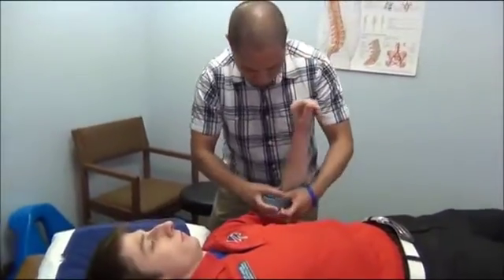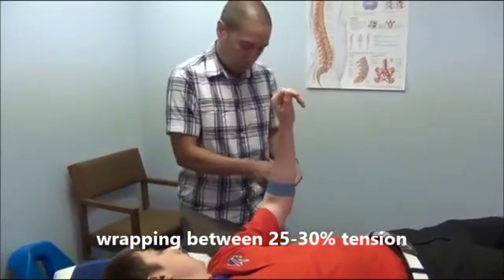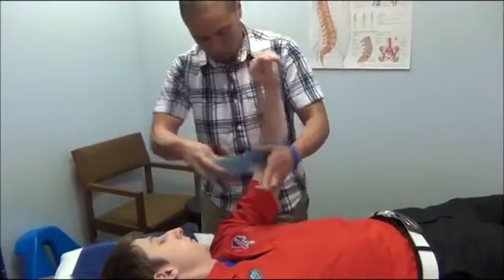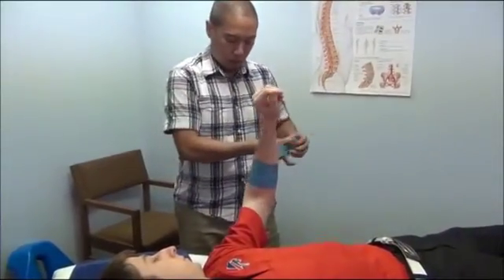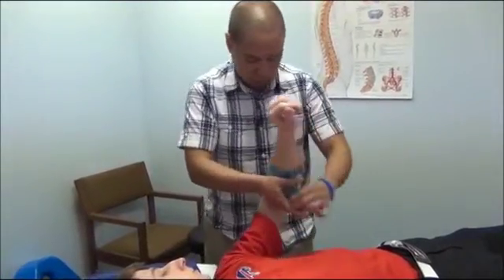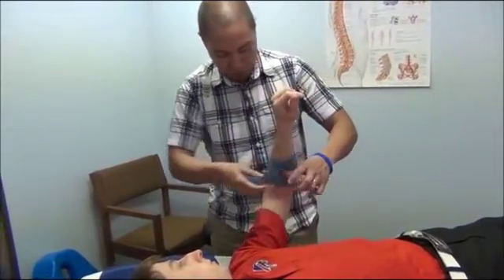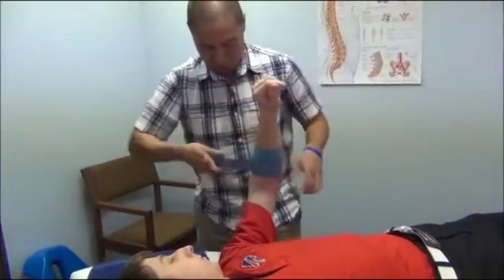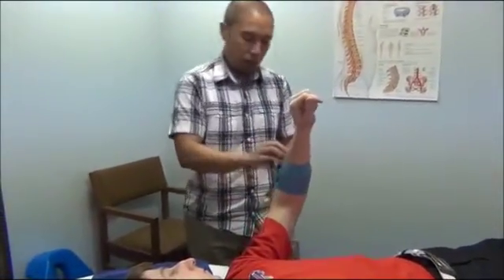Because there's not a lot of tissue here, I'm only going to wrap between 25 and 50% compression. I'm going to wrap around the part of the forearm where there's most likely restrictions or potential maybe median nerve entrapment underneath the pronator. But in general, what we're looking for is just to get some skin movement here and stimulate a lot of receptors to give that brain information so it can release the lockdown on this motion.